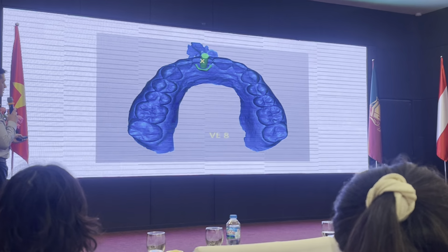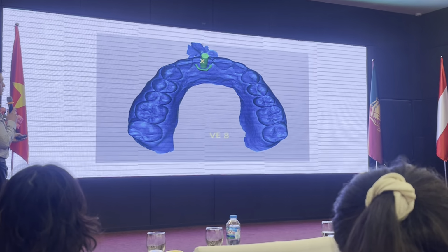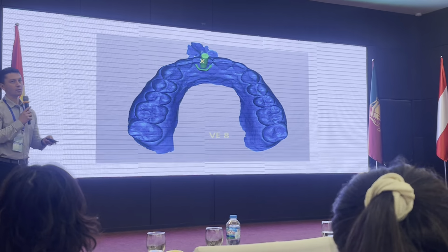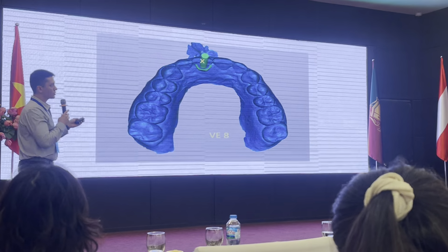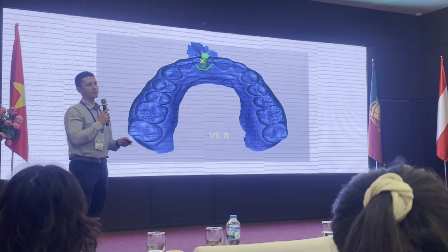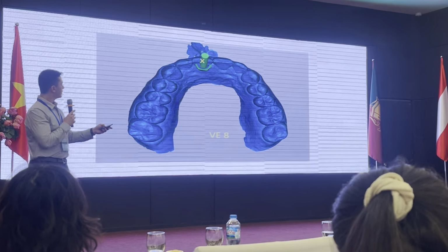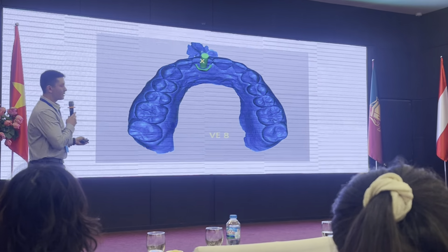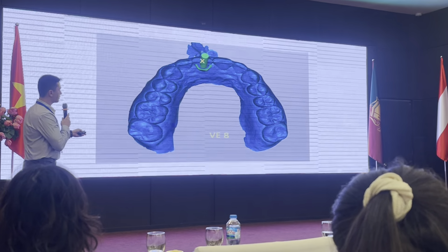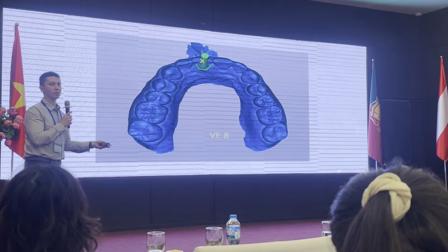There's an X marked here because this is our tooth that's planning to be extracted. Notice where that green cylinder is right there. Like Doug was showing earlier, he showed that surgical kit that had what we call paralleling pins. Paralleling pins are there for our prosthetic positioning. We put a paralleling pin inside of the implant, so it's telling us where the straight line axis of the implant emerges from the prosthetic position of the tooth.